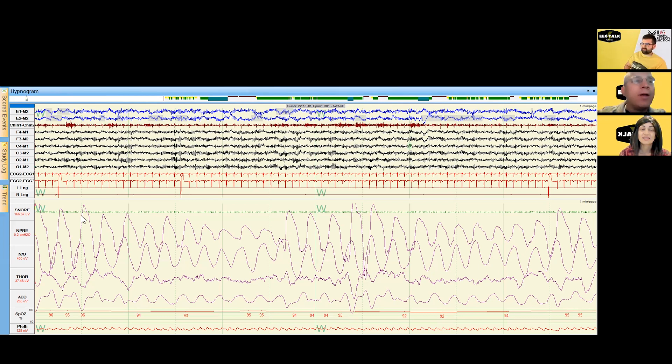With so many different signals related to breathing, why not just the abdomen and thorax belts? We look at nasal pressure and the thermistor because we score different types of events from those two leads. We examine respiratory effort to identify the difference between an obstructive event — where there is persistent respiratory effort — versus a central event, where that effort dissipates. We also quantify limb movements to see if they correspond with a clinical history suggestive of restless leg syndrome.